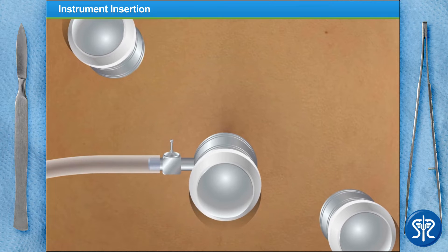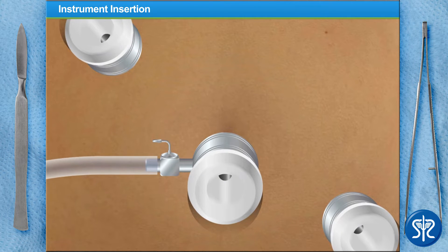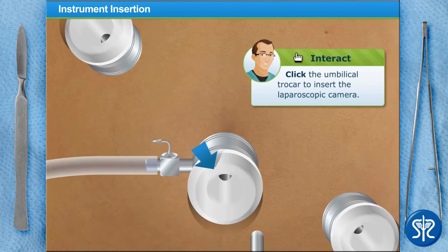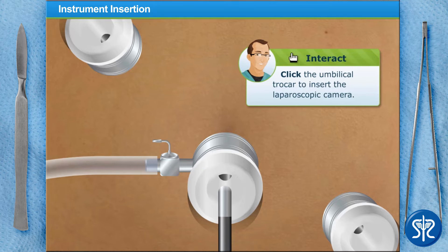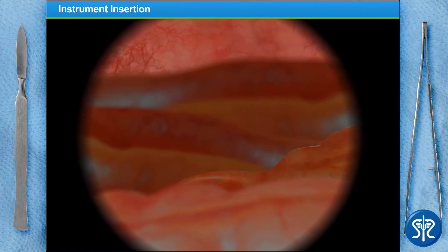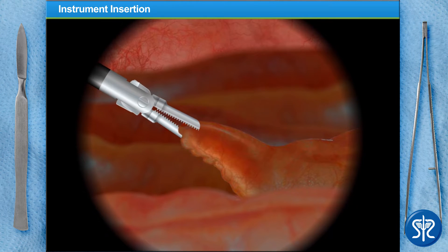Next, we need to insert our laparoscopic camera through the umbilical trocars. Images from the camera are projected on our monitor to allow us to inspect our patient's abdomen and confirm that the appendix is infected. The inflamed and swollen area you see is the patient's appendix. Our next step is to remove it before it becomes an even greater problem for our patient.